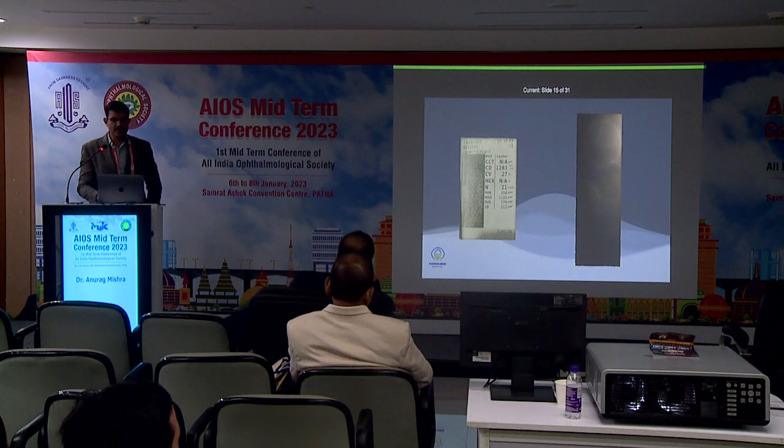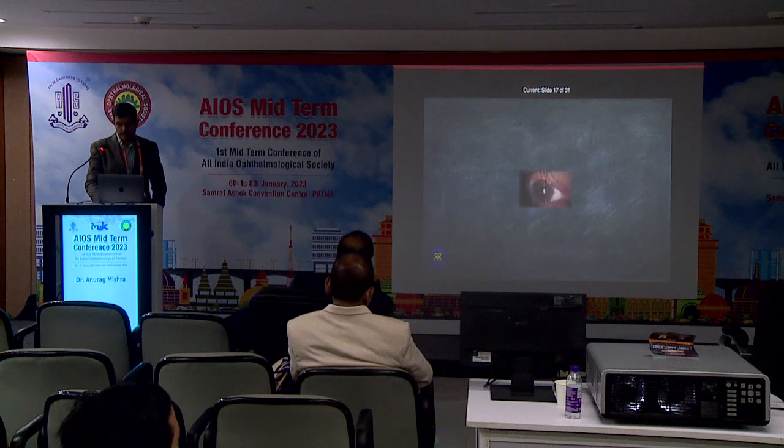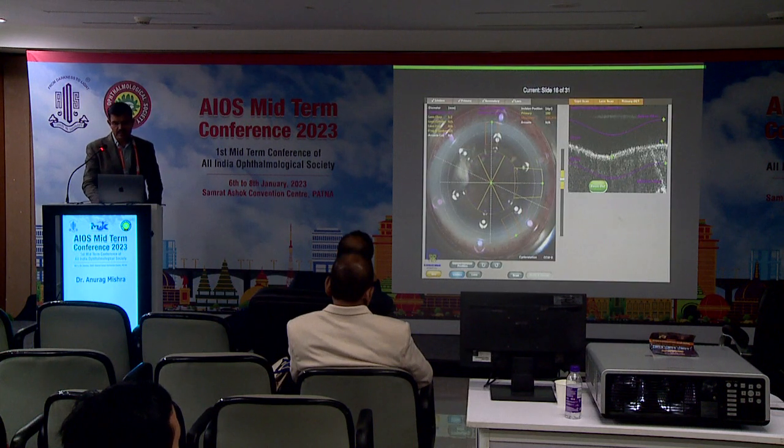This was another case wherein the endothelial cell was not showing any count on the specular microscopy, as you can see in the picture. It was very, very low indeed. So luckily for us, the patient just decided to get a FLACS done. So we went ahead and did it after adjustment to the capsular margins.